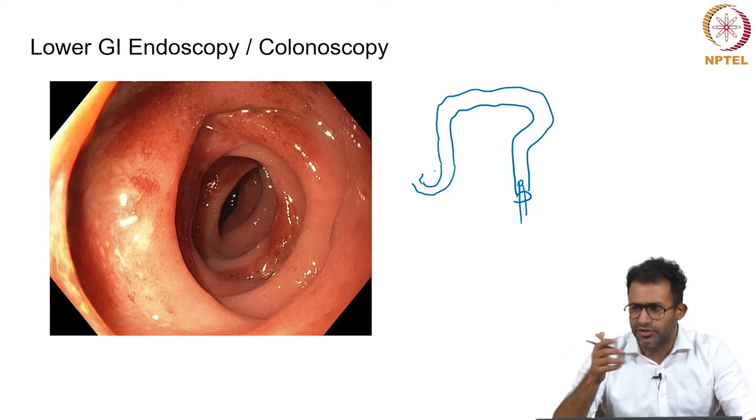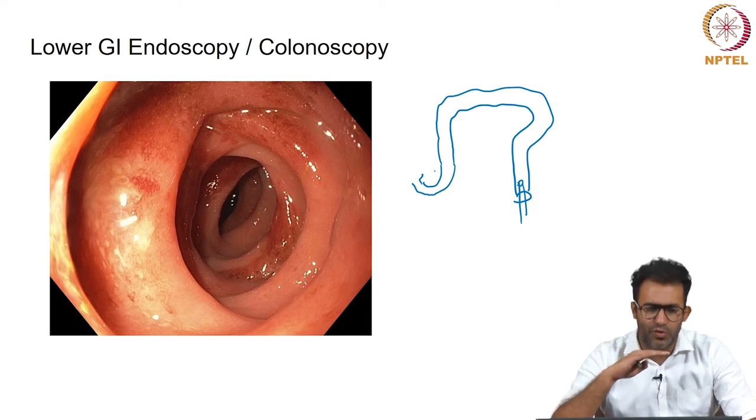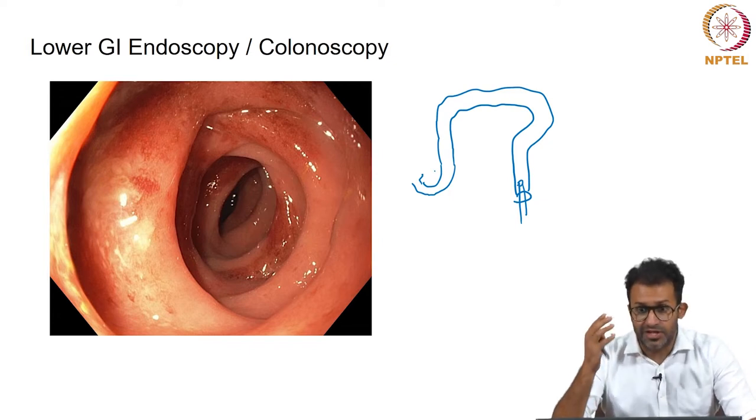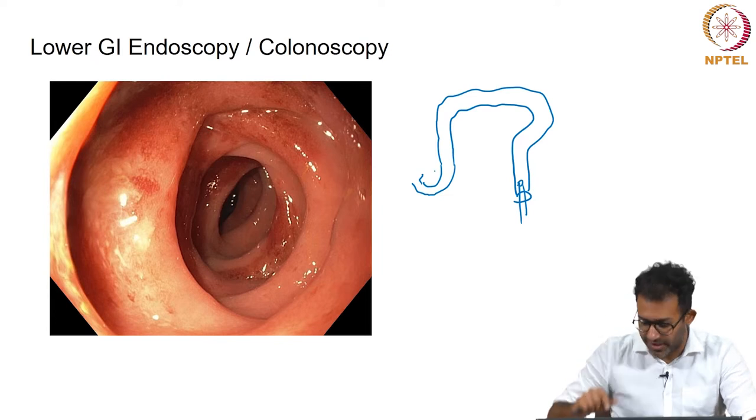Again, it can be diagnostic or therapeutic. Diagnostic colonoscopies are performed on a day-to-day basis. Thousands of them are performed every day in India and all over the world. It's a very common procedure, and in most parts of the world, it's a daycare procedure. It can be therapeutic too: you can remove small polyps and do certain small procedures through colonoscopy as well.